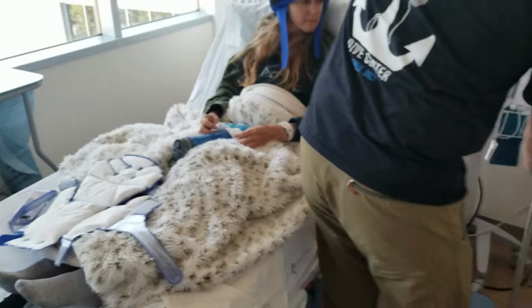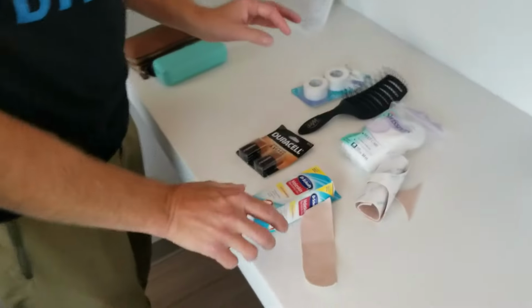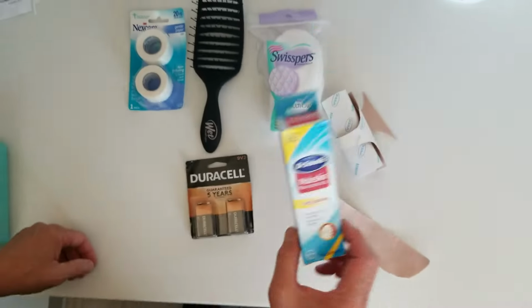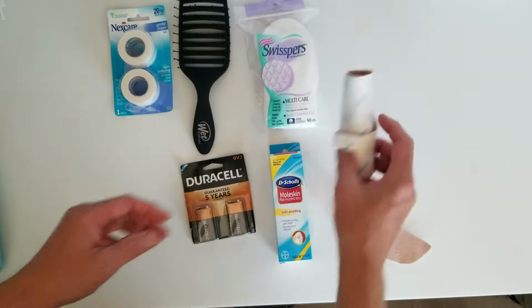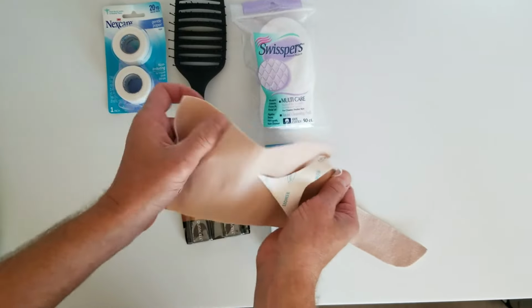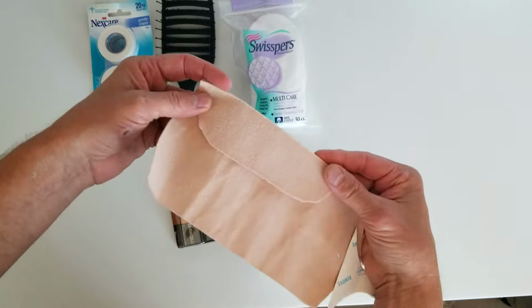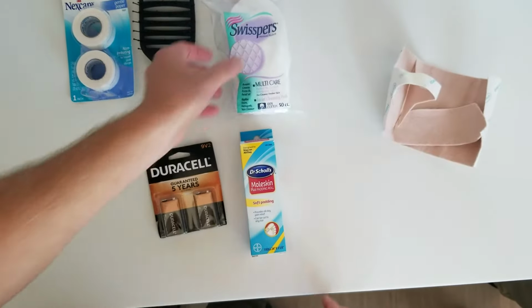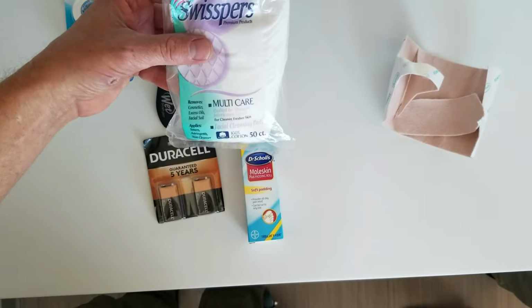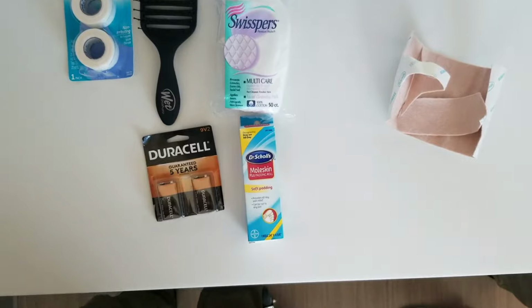If you come over here, this is our little kit that we have, just some recommendations. So moleskin, you picked that up at Amazon. It comes in a roll here. That's for the forehead, and we created an initial template and then cut like 4 of these out. She has 4 treatments, and that sticks in the forehead. These things work pretty good. These multi-care cosmetic removal things, that's for the ears or up in the temples.